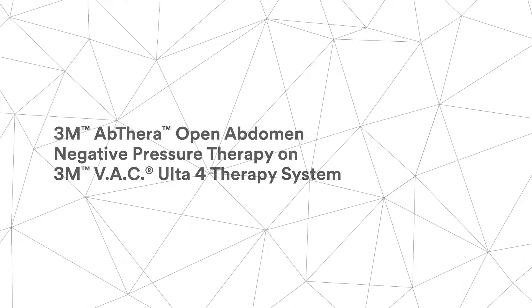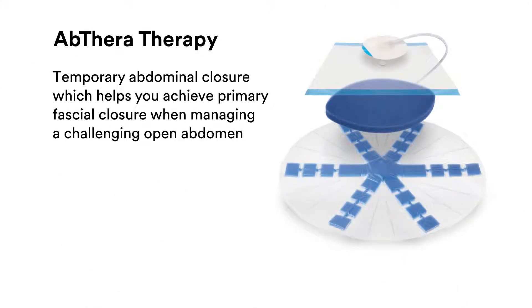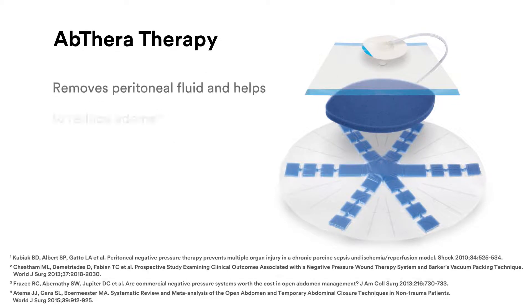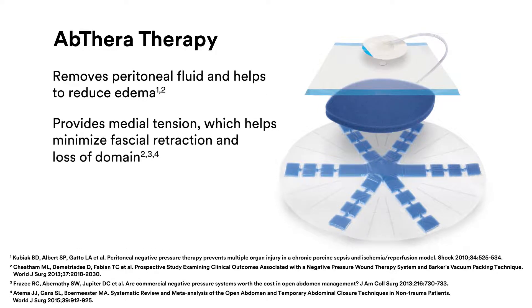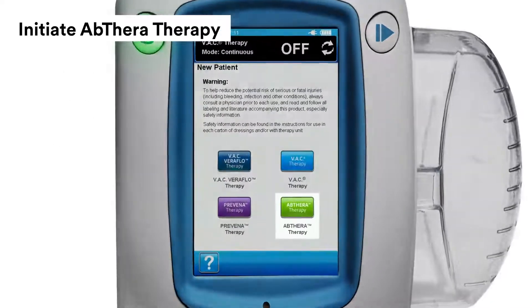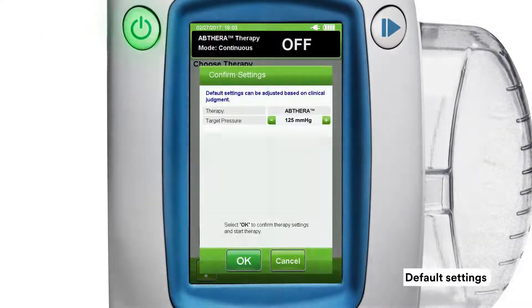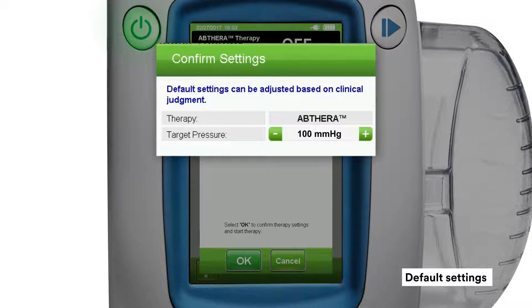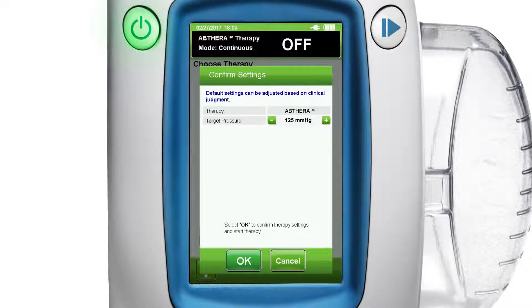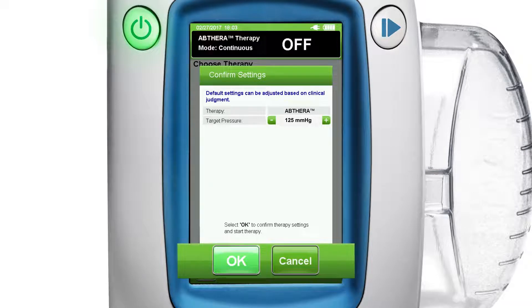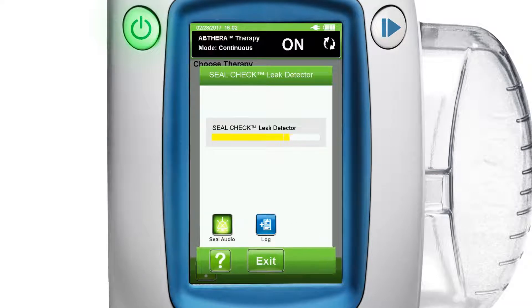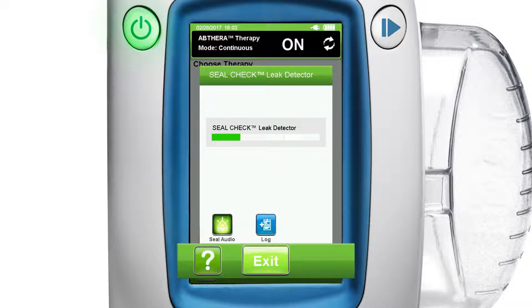3M Abthera Open Abdomen Negative Pressure Therapy provides temporary abdominal closure, which helps you achieve primary fascial closure when managing a challenging open abdomen. Abthera therapy is designed to manage the open abdomen by removing peritoneal fluid and helping to reduce edema, providing medial tension which helps minimize fascial retraction and loss of domain. To initiate Abthera therapy, press the green Abthera therapy button. The confirm settings screen gives you an option for target pressure of 100 to 150 mmHg, which you can adjust using the plus and minus signs. Once adjusted, press the green OK button to accept settings and begin Abthera therapy. Press the exit button on the seal check leak detector screen to go to the active therapy home screen.